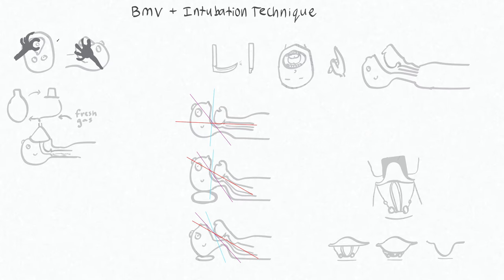Starting out with bag mask ventilation, let's say we have a patient here who is actually asleep because they'll be sleeping when you bag mask them. We want to bring the patient's face up to this mask and then apply firm pressure so that we don't have a leak or we have a good seal.